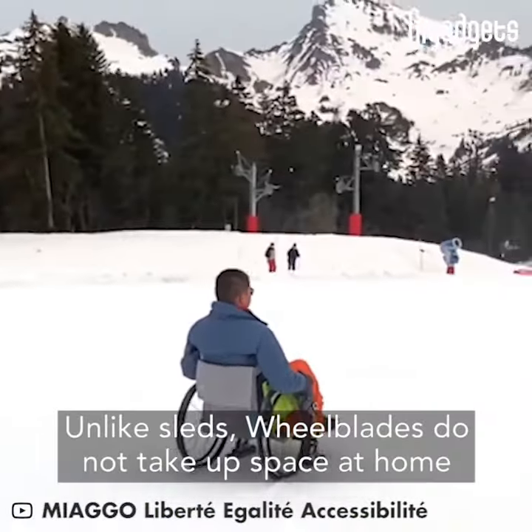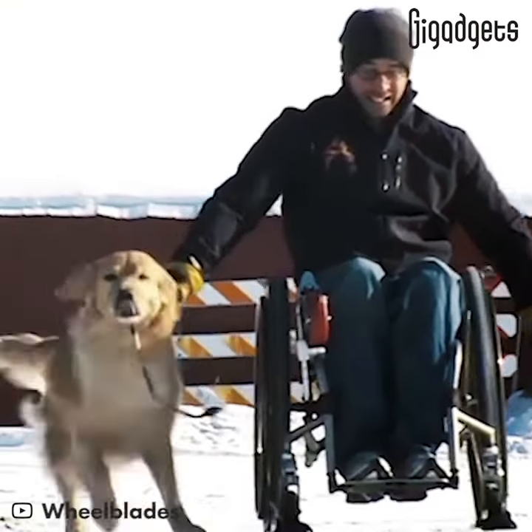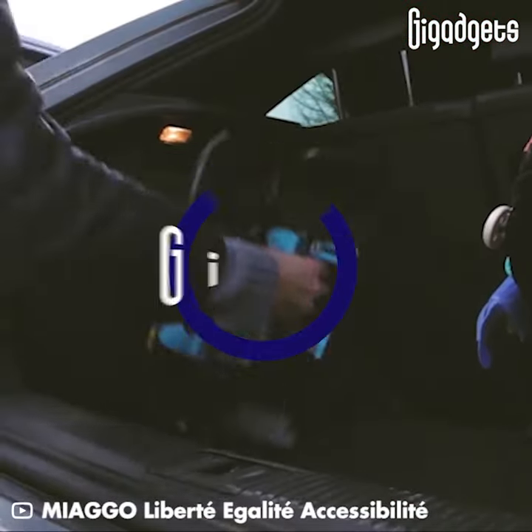Unlike sleds, wheel blades do not take up space at home. They can also be easily removed in a short period of time.